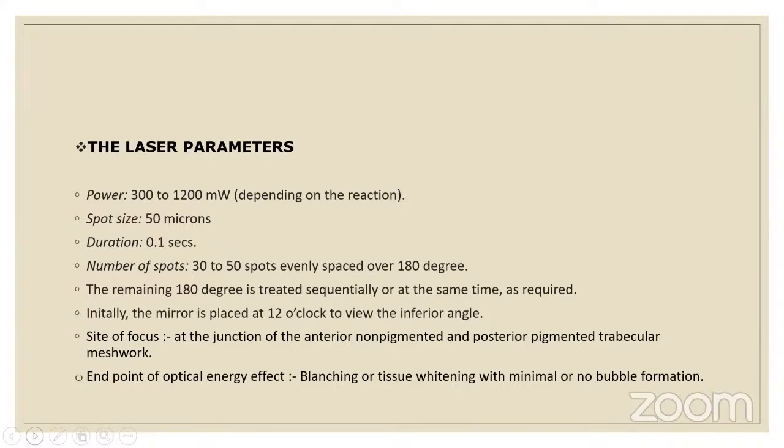Spot size is 50 micron. Duration is 0.1 second. Number of spots is 30 to 50 spots in 180 degrees. The remaining 180 degrees is treated subsequently or at the same time as required.